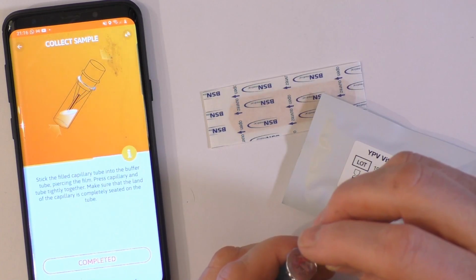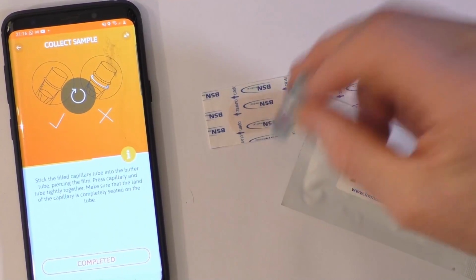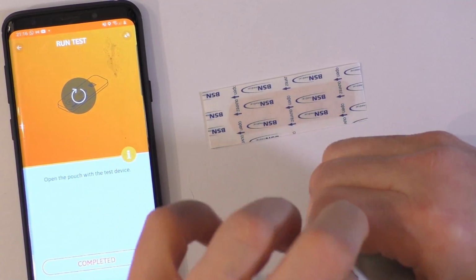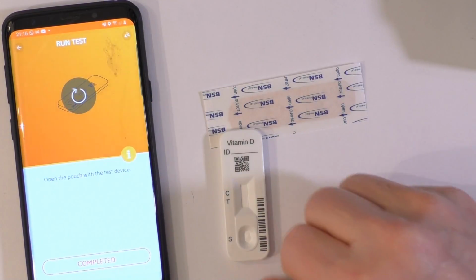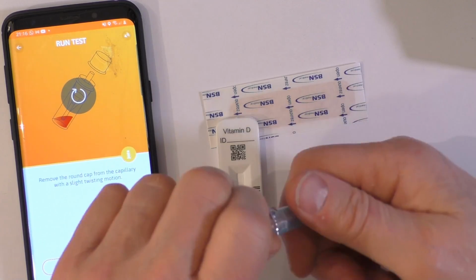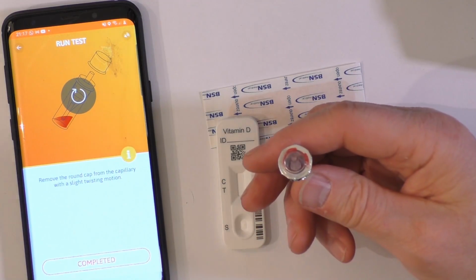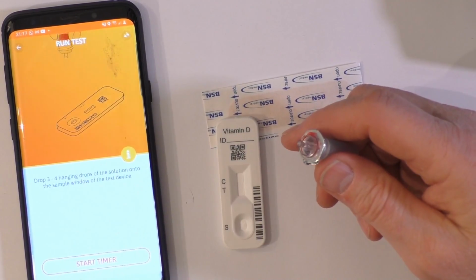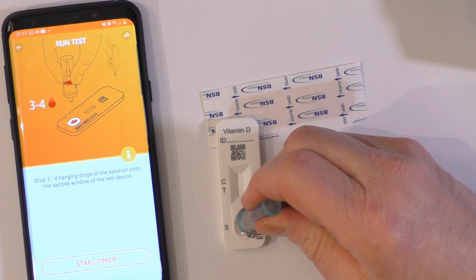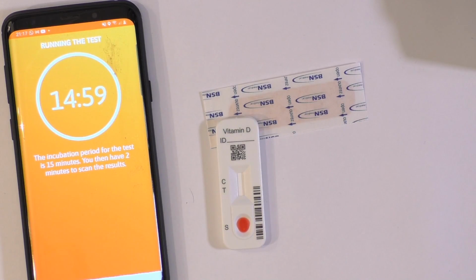Now that bit goes into there. And we give that a bit of a shake up. Now we take out the test kit bed. And there we have it. Okay, so that bit's completed. Now I remove that, still bleeding, remove that cap. No, not that one. Remove that one, that's it. And then I put some drops on there, 4 drops I think it says. 1, 2, 3, 4 drops. And we start the timer. And we wait for 15 minutes.